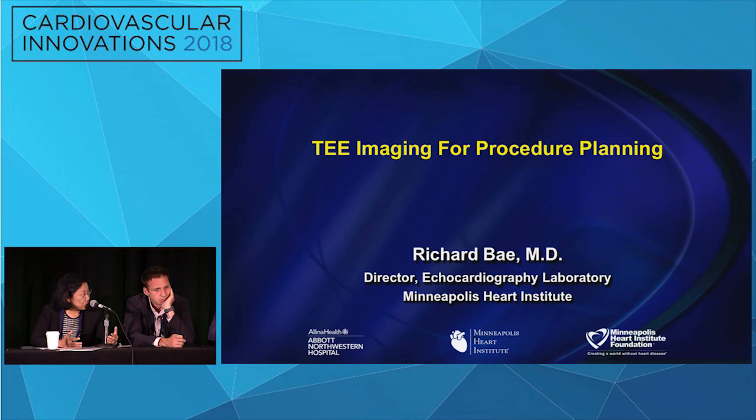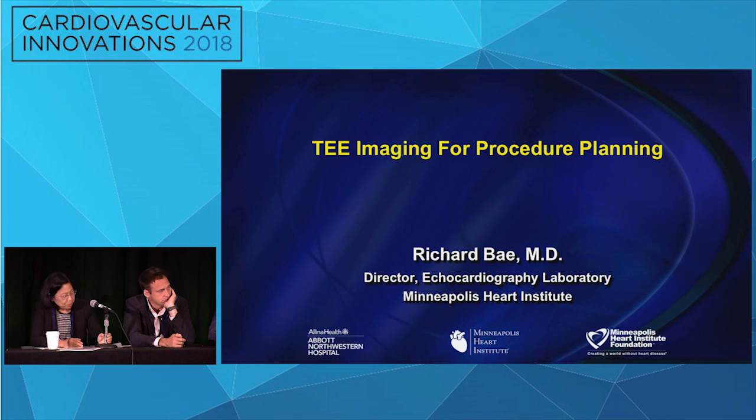This transgastric view example: you don't really see any septal leaflet — this patient previously had an EP ablation and the anterior part of the septal leaflet is adherent to the septum. This highlights that the transgastric view can often be more helpful than a 3D view in localization, and that patients can have quite variable anatomy. This patient effectively has a bicuspid tricuspid leaflet with not much of a commissure between the anterior and posterior leaflets.